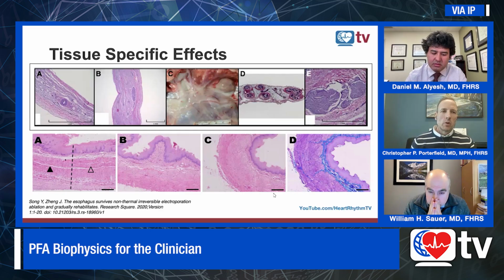The interesting part with current-based, with pulse field, it appears that this low conductive myelin sheath of the phrenic nerve spares it, even though we will see temporary or transient effect. Within 3 to 5 minutes, the effect is back, and the phrenic nerve is no longer affected. It's been looked at in many studies and well demonstrated in the article that you have mentioned.